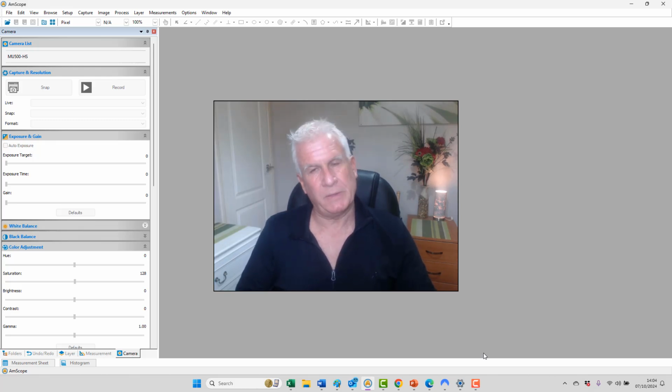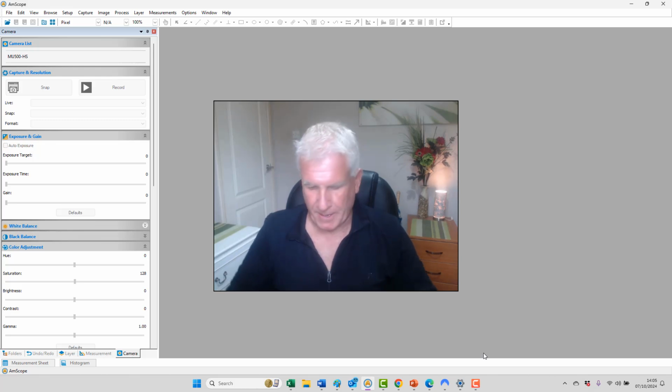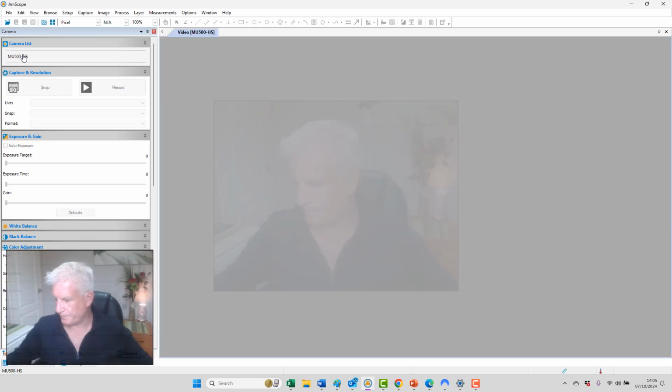Just to give you a deeper understanding about what I'm doing when I'm doing this assessment, it's always interesting to see what we can come up with and look at the clues that we see in the blood that can tell us a lot. Okay, all right, let's get this switched on and let's have a look.